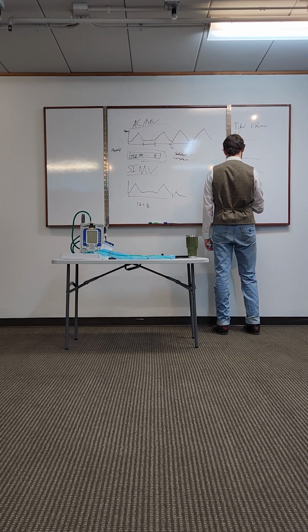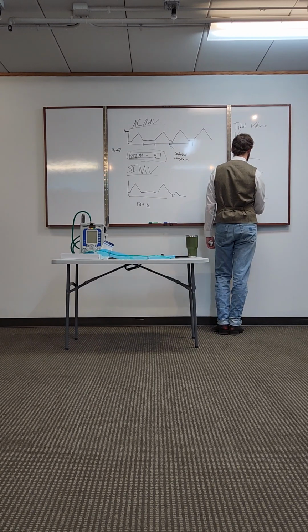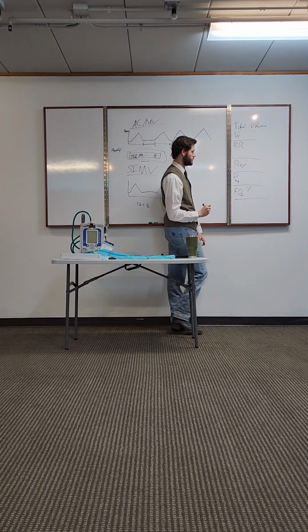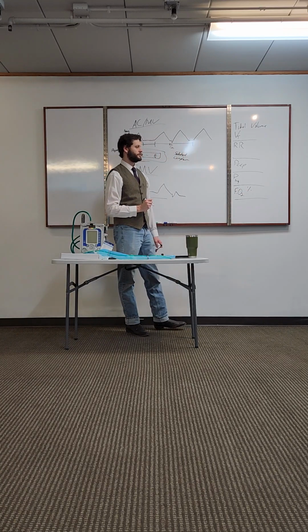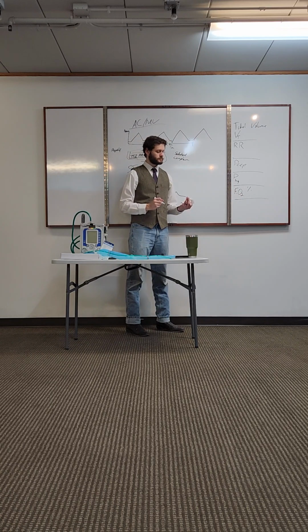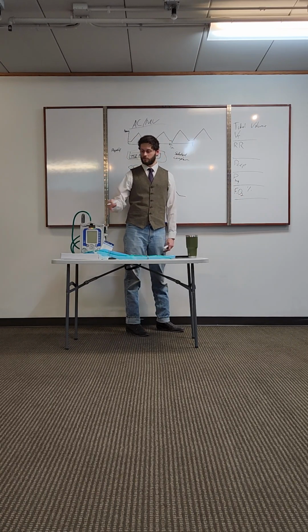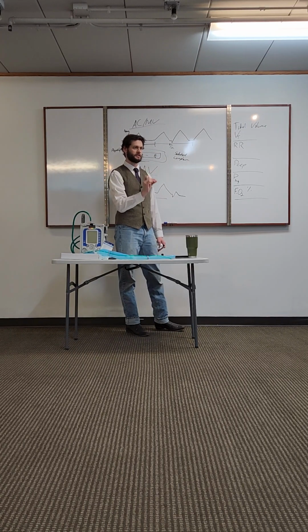And FiO2. This is usually going to be in percent. Anymore, everything is moving to the blender-based FiO2s, so it's a fraction of inspired oxygen. With that, the Z-Vent's actually wonderful. You can really easily dial it in and get it set right.